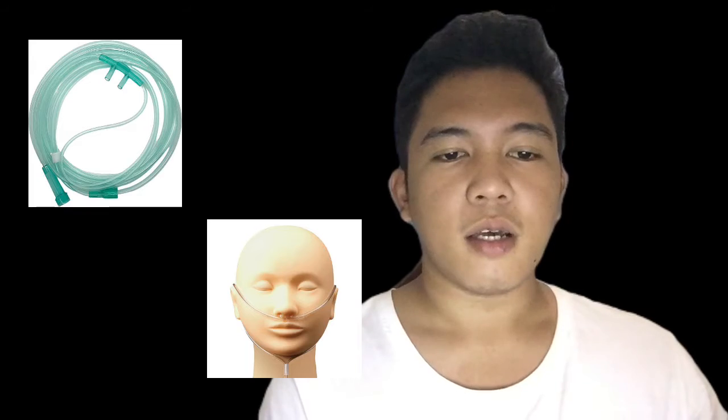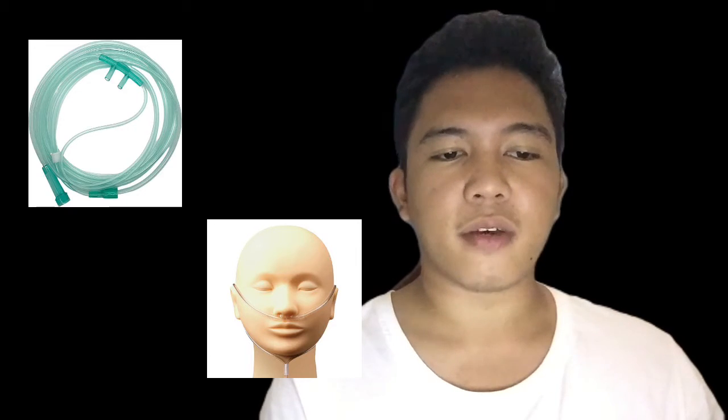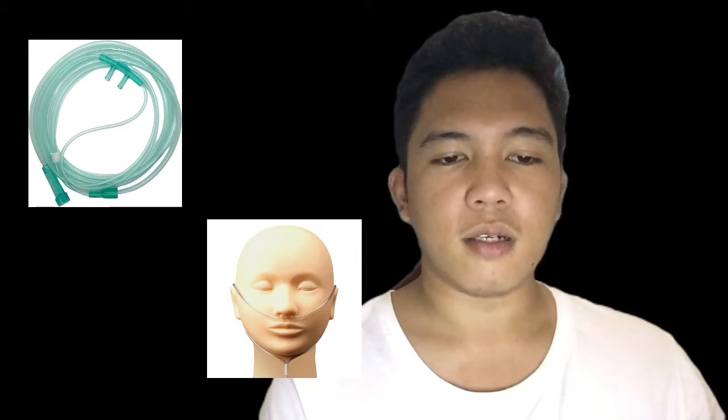And there are advantages. First is comfortable for the patient. Next is ideal for claustrophobic patients. Next is ideal for oxygen dependent patients requiring small amounts of oxygen and home use. And the last advantage is the humidification or the bubble bottle is not required up to 4 liters per minute LPM.